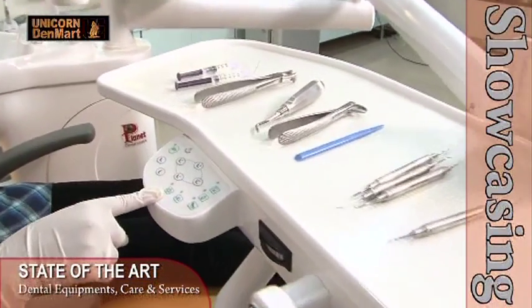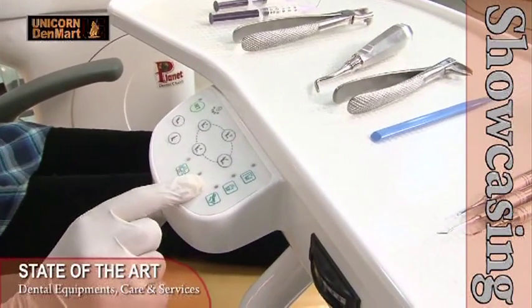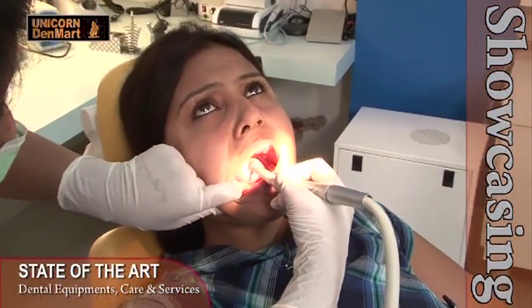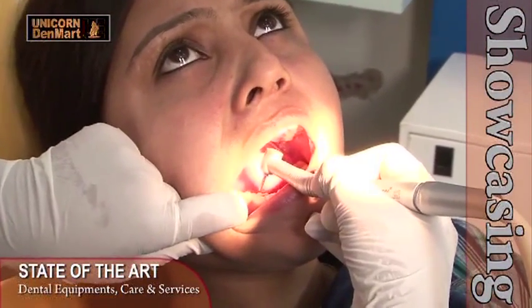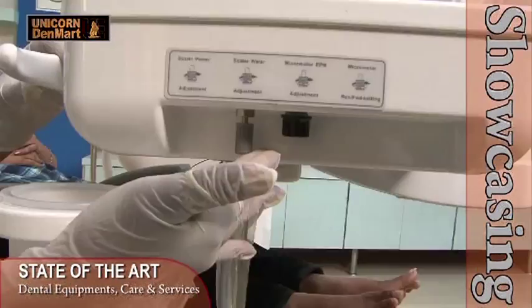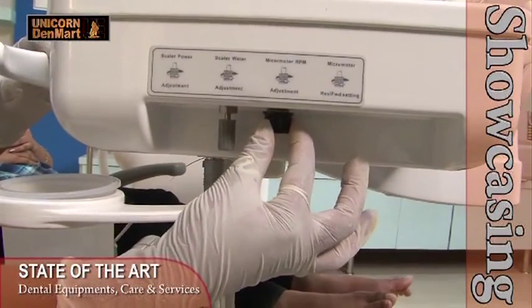With a responsive feather touch control panel, Planet allows the user to operate different functions of the chair easily and conveniently. Designed with an air pressure gauge, the dental unit regulates the air pressure through the air rotor. This unit also has individual water control knobs below the delivery unit to control the water spray through the handpiece.